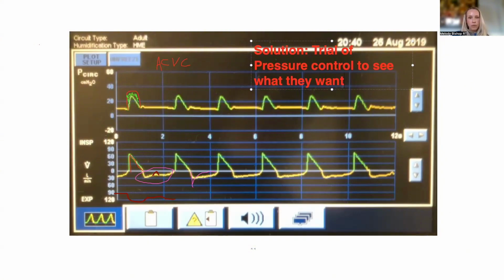And the other thing is, if you're in the situation where the patient needs to be affixed to the ventilator, then your hands are kind of tied. You're going to have to increase sedation and/or use paralytics if you decide that whatever the settings are are important and the patient needs to follow them, if it's ARDS or obstructive disease, whatever it is. Because when you limit volume, and the patient's respiratory center is on overdrive for whatever reason, whether it's acidosis or other things, if you don't allow the patient to do that, they're going to do what they're going to do, and this is what you're going to get, right?